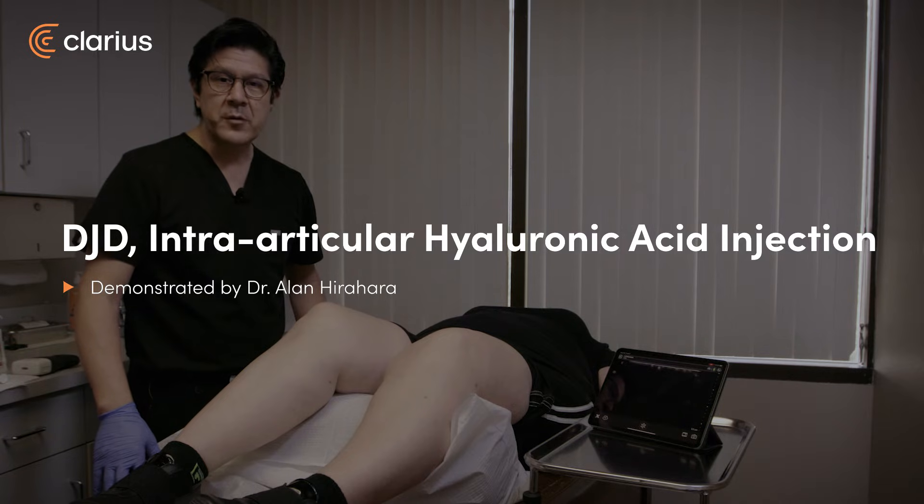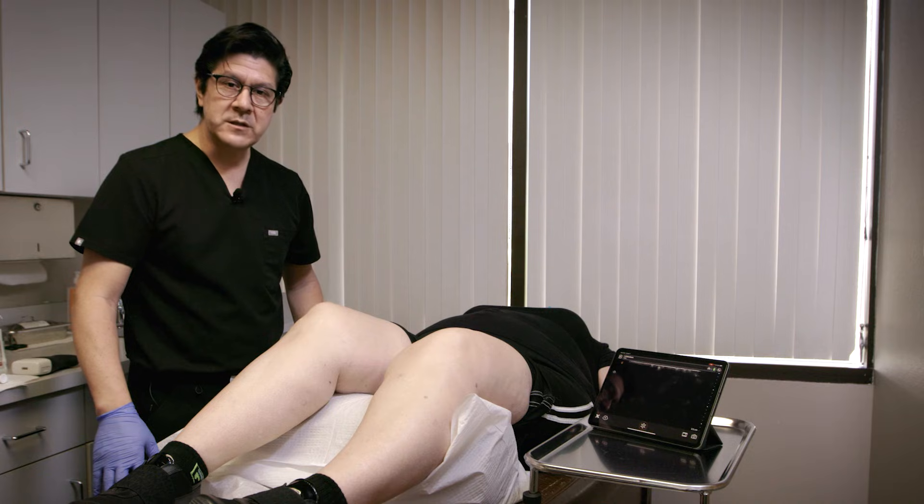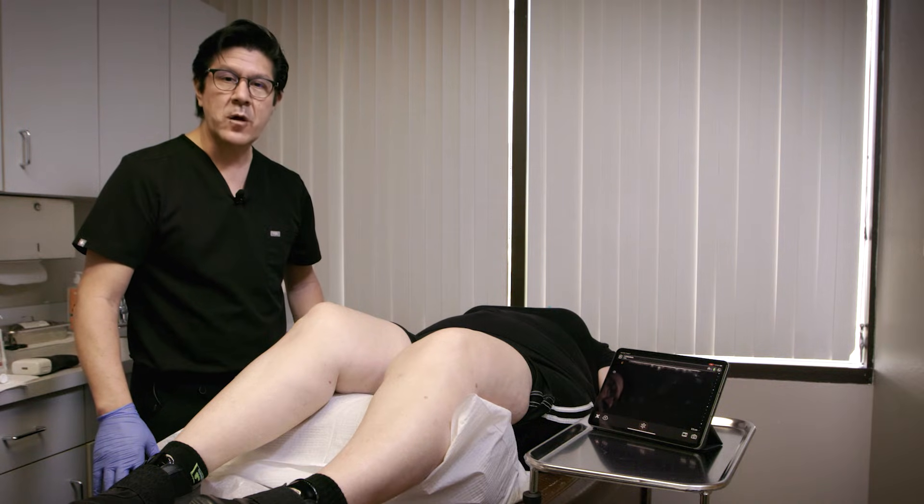Hi, my name is Alan Hirahara from Sacramento, California. We'll be doing an injection under ultrasound guidance to the right knee using hyaluronic acid for degenerative joint disease.